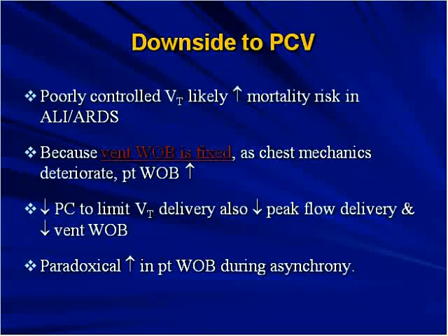Now, the other aspect of pressure control, the downside, is that as you decrease the pressure control to limit tidal volume delivery for lung protective ventilation, you also decrease the peak flow delivery and you decrease the ventilator work of breathing. So paradoxically, this can actually increase the patient work of breathing, particularly when they become asynchronous.